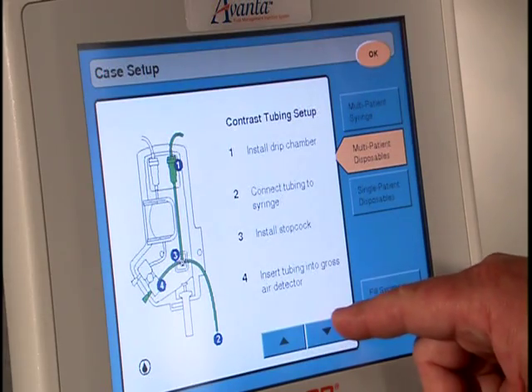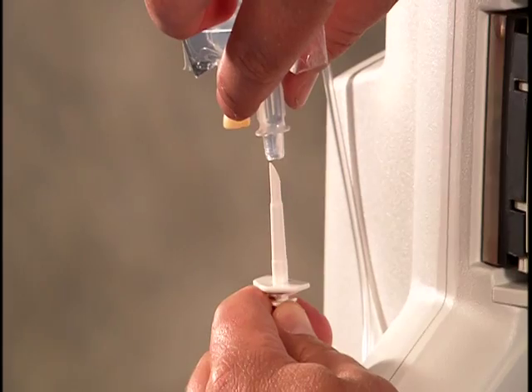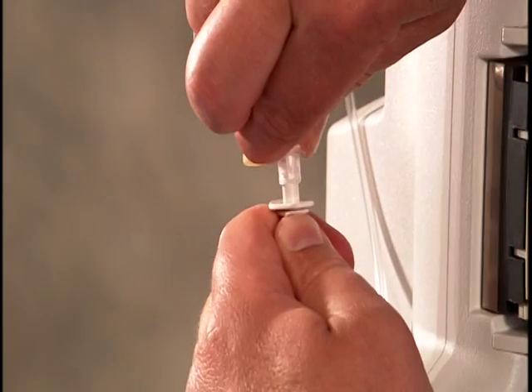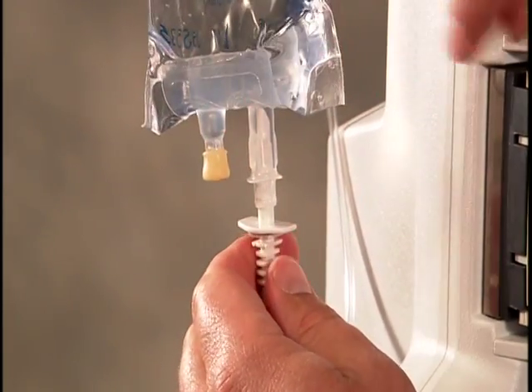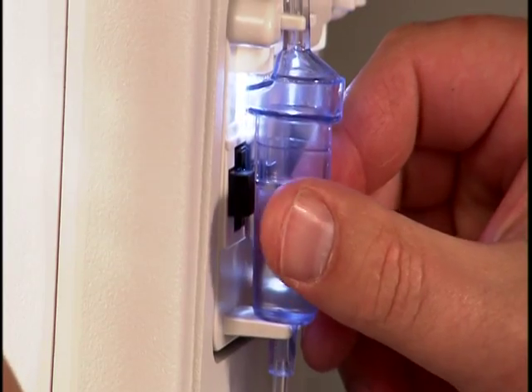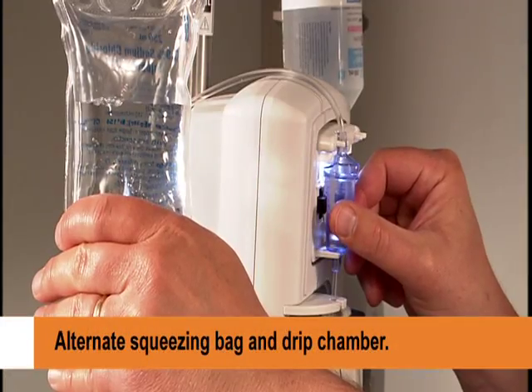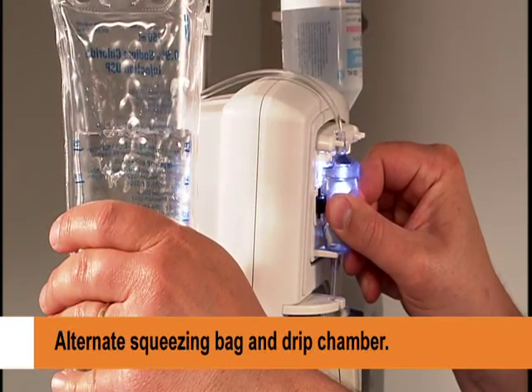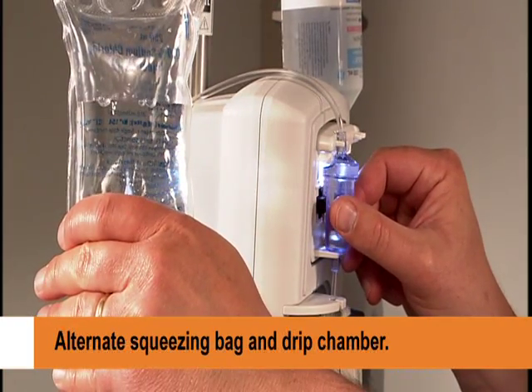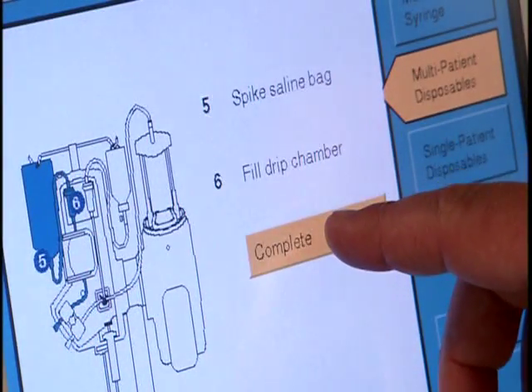Touch the down arrow to view remaining steps. Step 5. Spike the saline bag. Step 6. Fill drip chamber completely. To speed the process, hold the saline bag in one hand and the drip chamber in the other, and alternately squeeze the bag and the drip chamber. When the drip chamber is full, touch Complete.